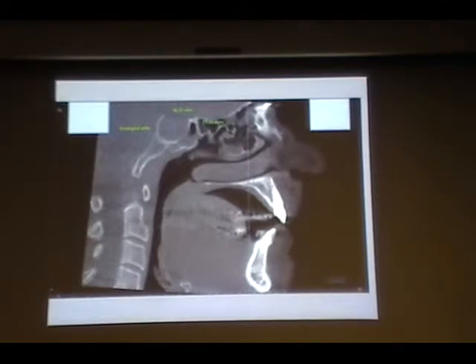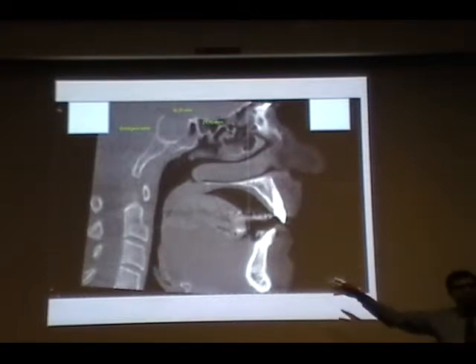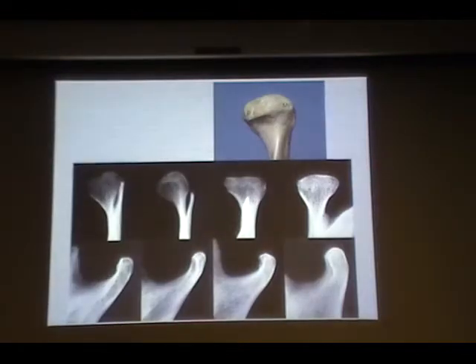Remember, when you take an image, it is your responsibility to read it and provide a comprehensive treatment plan. Or at least you can say there is some abnormality which I'm not too comfortable with, and I'm referring it to the physician to take care of. Having said that, it's critical that we know what normal anatomy looks like, right?